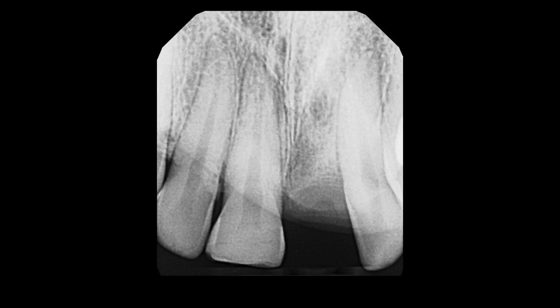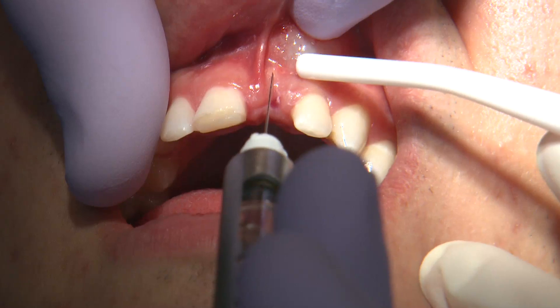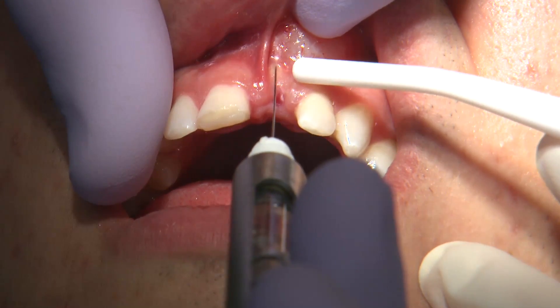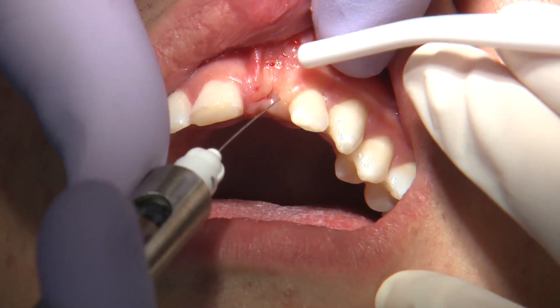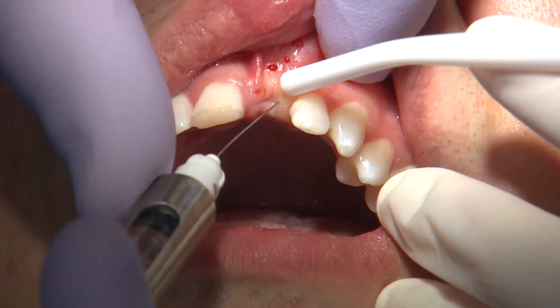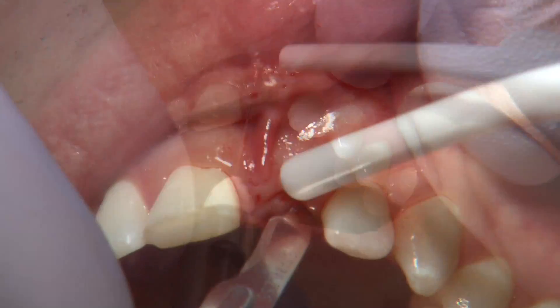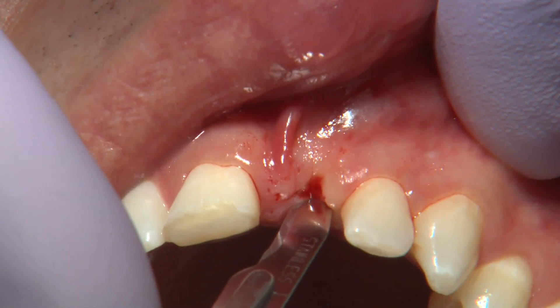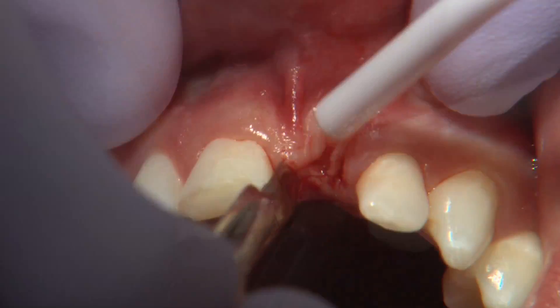The patient had a bone graft procedure completed before being referred to me for implant placement and restoration. I went over the patient's health history and performed a comprehensive exam, collected a full arch impression, and had the laboratory fabricate a surgical guide so I know exactly where to place my implant based on where the final restoration is going to be — a prosthetically driven implant placement.